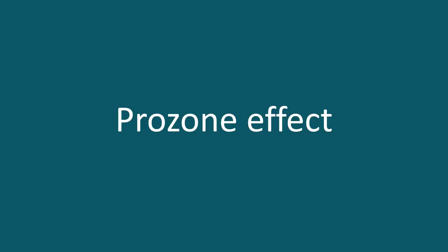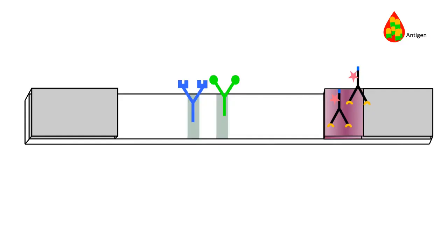Let's talk about a very important, because very dangerous, effect in actually all serological assays, the prozone or high-dose hook effect. The prozone effect happens when we have a sample which is full of antigen, usually caused by hyperparasitemia. If we add a blood sample which is full of antigen to our strip, the antigen will bind to the antibodies of the conjugate, but there are more antigens than the conjugate can bind, so free antigens will remain.